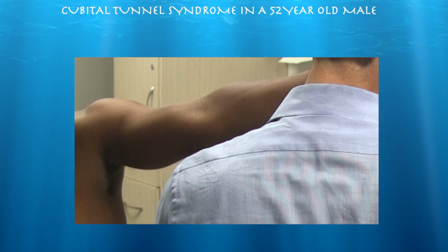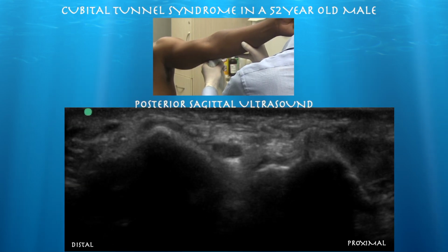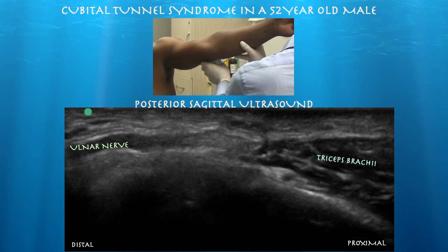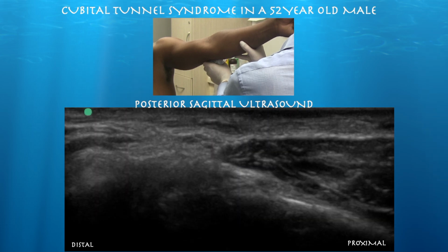Now I'm going to turn on this one also. At 10:48, we're going to try to go long axis to it. So here you can see the ulnar nerve in a sagittal plane or long axis to the ulnar nerve, and it's fairly constant in its diameter.